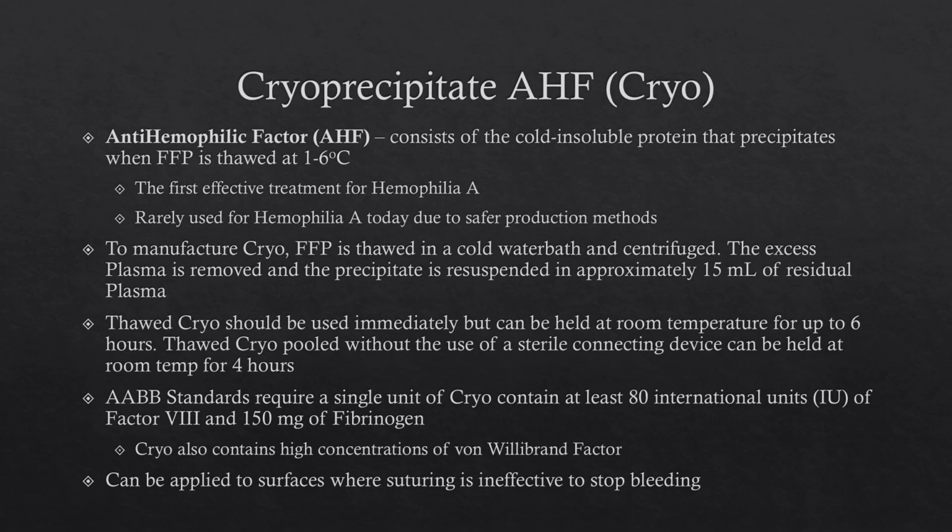Cryoprecipitate AHF. I was telling you about the chunky plasma. The cryo is deliberately made chunky plasma. You thaw an FFP at a cold temperature, and then you will get these cold insoluble proteins that will precipitate out.